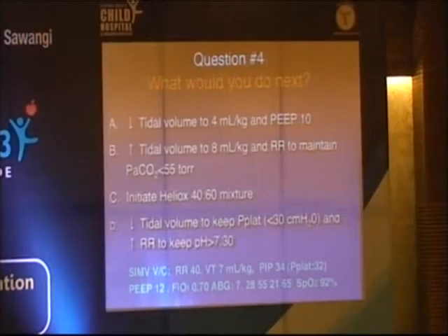The reason why I mentioned increasing the respiratory rate here, this is the correct answer, D. And the reason why I say increase the respiratory rate is because if you turn your tidal volume down, you're reducing alveolar minute ventilation. So always remember that you may sometimes need to turn your respiratory rate up to maintain an adequate alveolar minute ventilation.